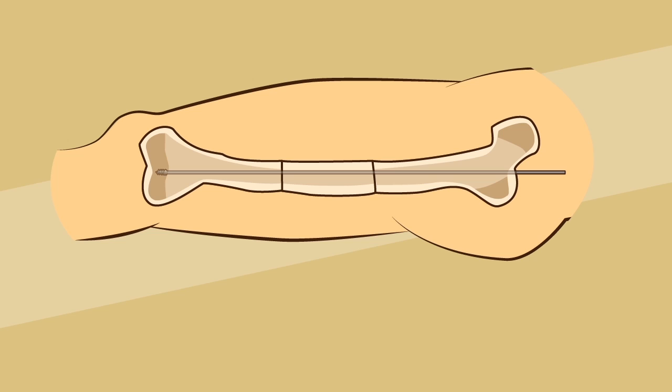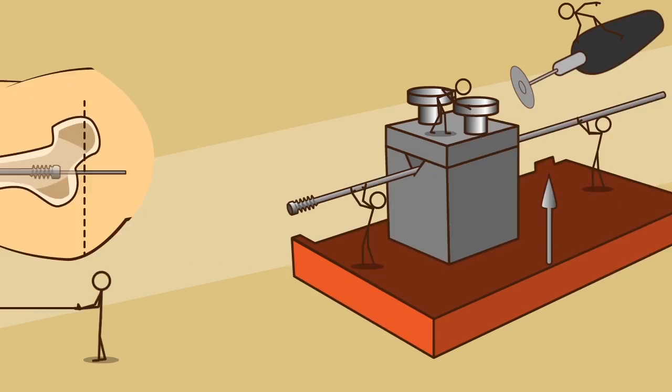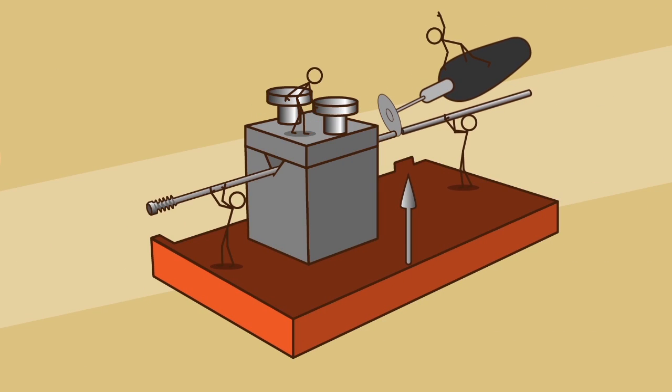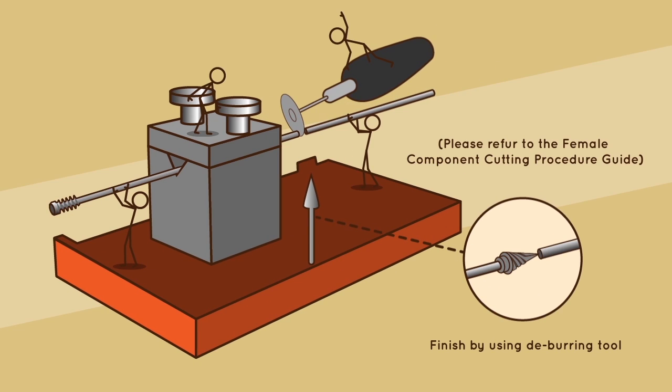Female cutting. The female component is now cut to the required size. The implant can be overlaid on the patient's leg to establish the required implant length. The female component is cut using the FC cutting jig and diamond cutting disc mounted on a high-speed rotary tool. After cutting, a deburring tool is used to clean the inside lumen.